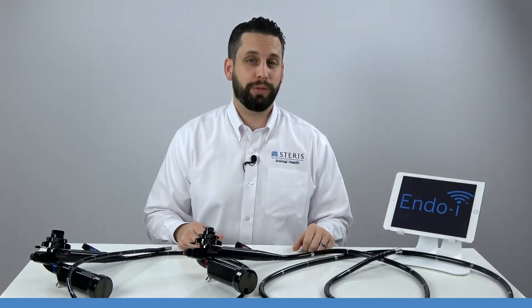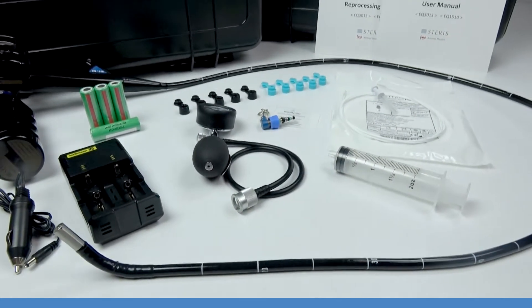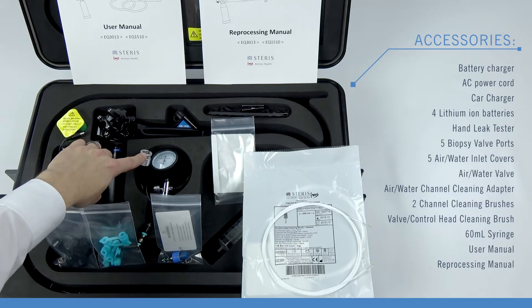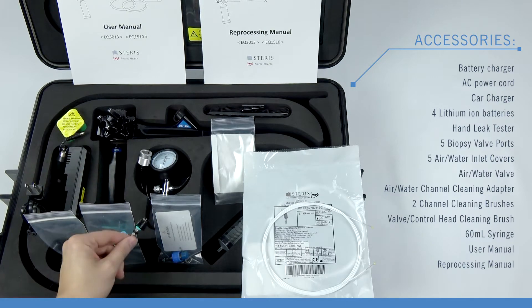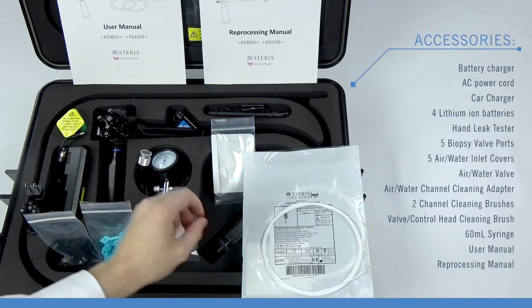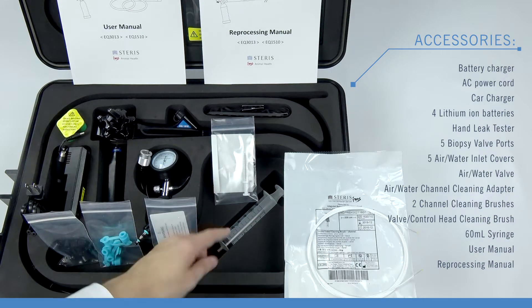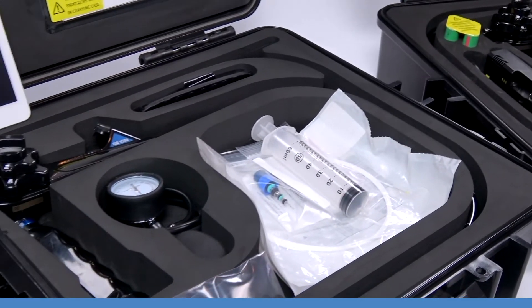Let's take a look at what comes with each EndoEye. Included with each EndoEye EQ1510 and EQ3013 are the EndoEye battery charger and AC power cord, car charger, four lithium-ion batteries, a hand leak tester, a package of five biopsy valve ports, a package of five air water inlet covers, an EndoEye air water valve, the air water channel cleaning adapter, a double-ended channel cleaning brush specifically for each model scope, a valve control head cleaning brush, a 60 milliliter syringe, and the EndoEye user manual and reprocessing manual — all packaged in a custom hard shell carrying case.